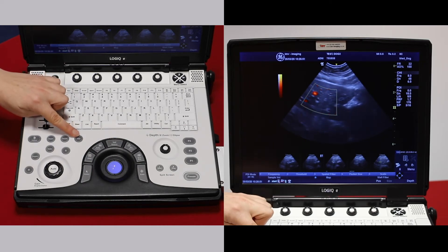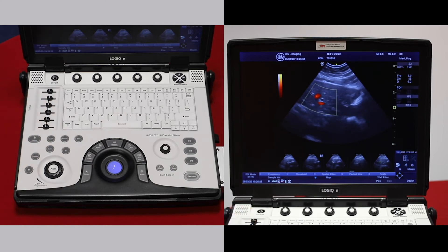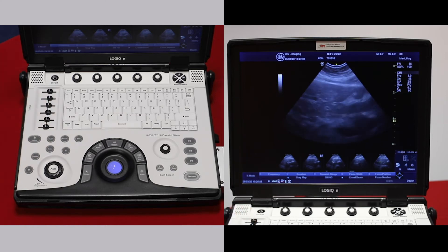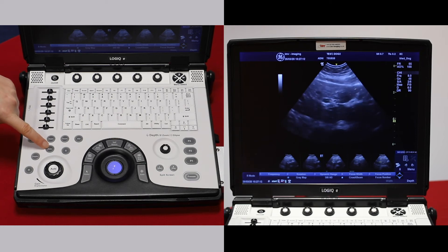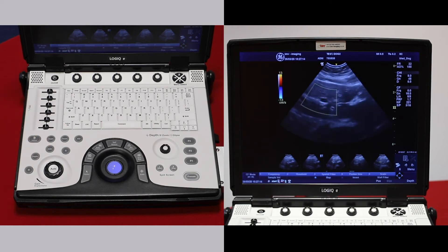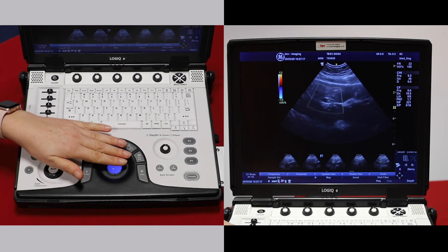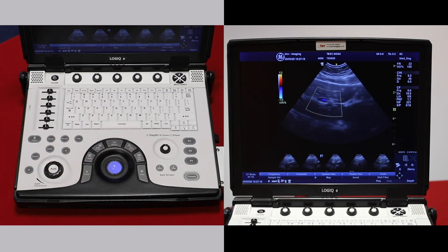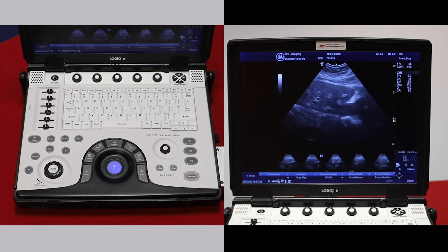To come out, press PDI, which is power Doppler again, or press B to come back to B mode. Color gives you color Doppler with directional flow. You can move the region of interest box around and again change the size just as we did before with the scan area button. Press B to come back to B mode.